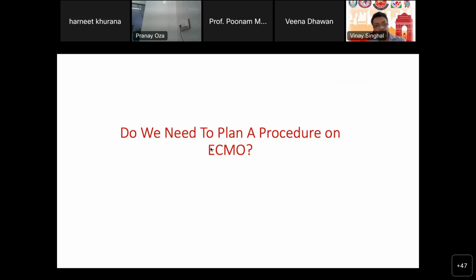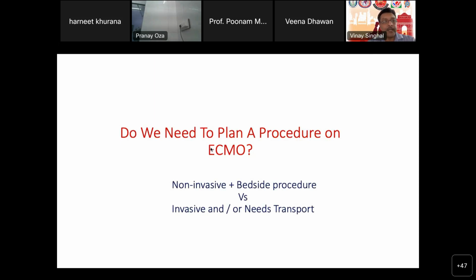So we have to understand: do we need a procedure? Do we need to plan a procedure on ECMO? Because there is a problem on ECMO, we may need to plan a procedure. So why do we need to plan a procedure on ECMO?